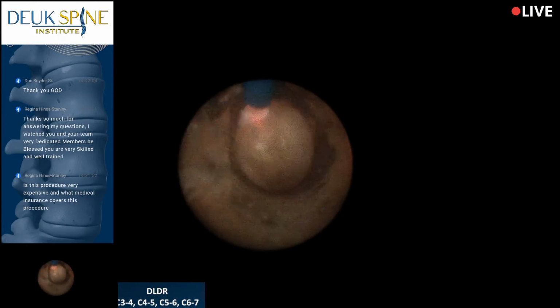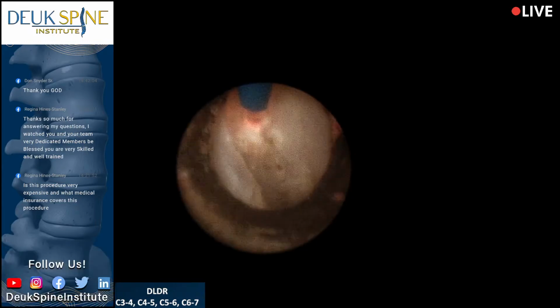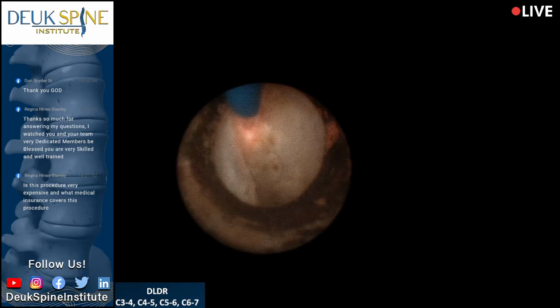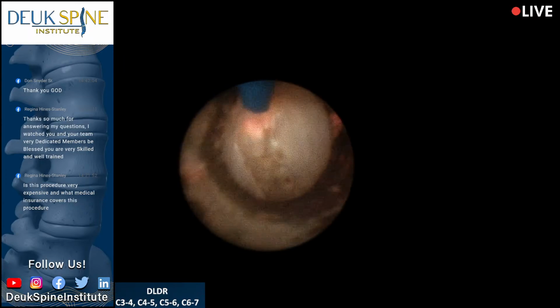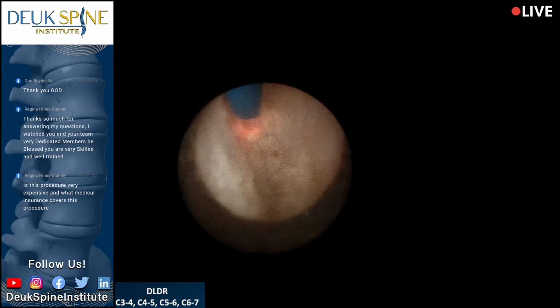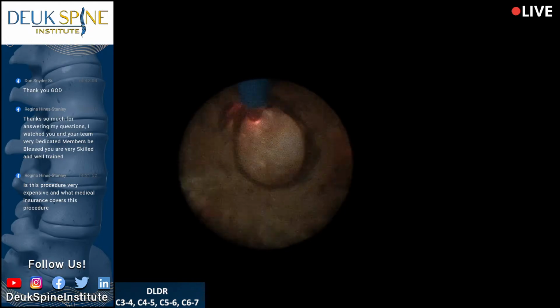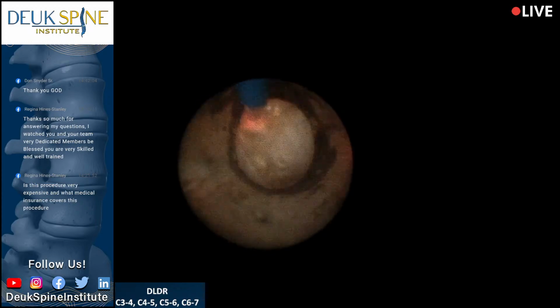Welcome back. We are still working at C6-7, the bottom disc we're supposed to fix today. For those of you who joined us a little late, we've already completed the 4-5 and 5-6. We found tremendous arthritis. On a scale of 1 to 10, it's a 10 out of 10 arthritis, and cleaned almost all of it out at those two discs. Now we're working on the bottom disc that we're fixing today, 6-7.